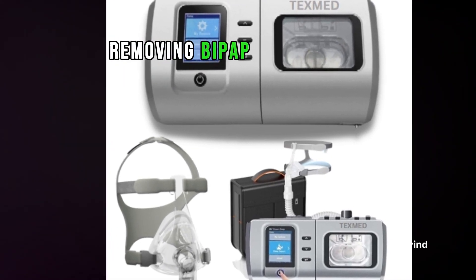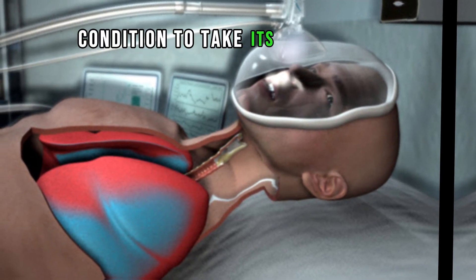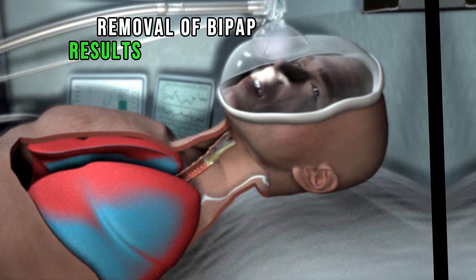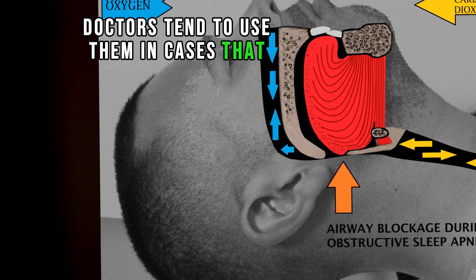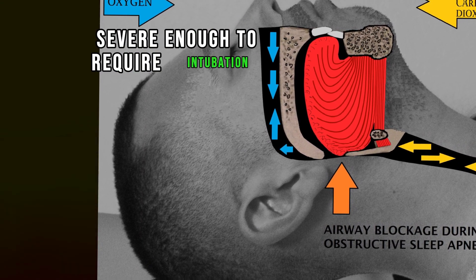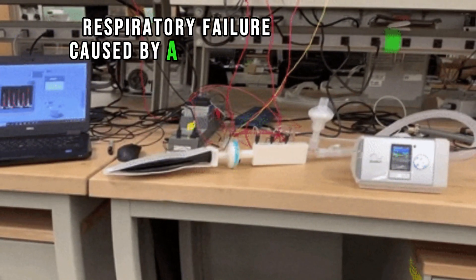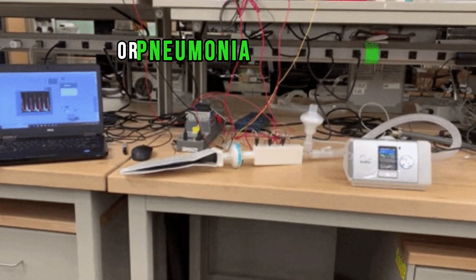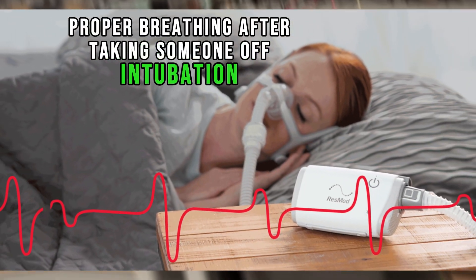Removing BiPAP is a decision to stop a medical treatment and allow the underlying condition to take its natural course. Removal of BiPAP results in the person's death, usually within hours. Doctors tend to use BiPAP in cases that aren't severe enough to require intubation — for instance, it might be used to treat respiratory failure caused by a COPD flare-up, pulmonary edema, or pneumonia. They're also used to ensure proper breathing after taking someone off intubation.